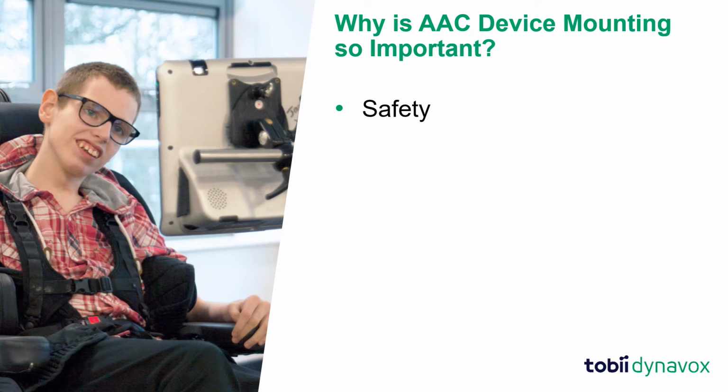A device mount provides a secure way of holding the device in place during use. Appropriate use of the mount prevents the AAC device from falling, which can injure the user, others, and the device itself. Proper mounting also supports proper positioning, which reduces physical pain, strain, or injury.